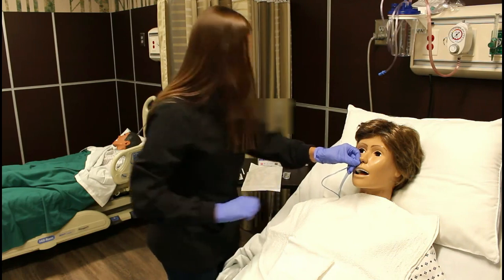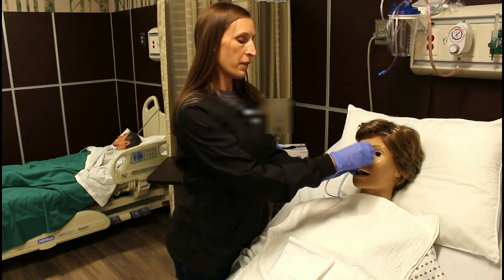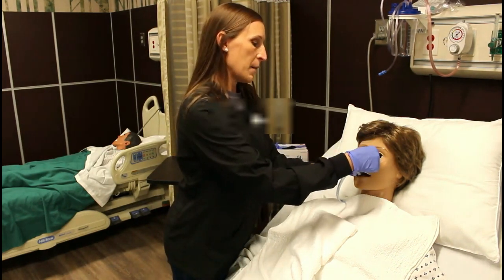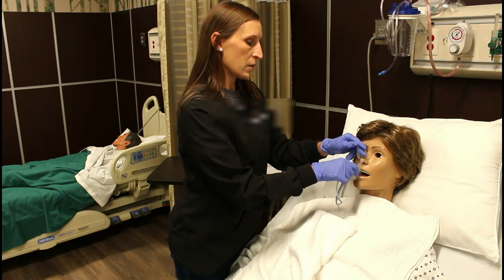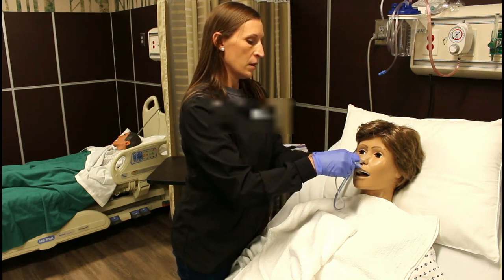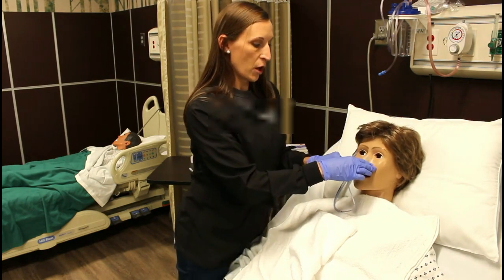Now we're going to take an alcohol pad and wipe the top of the nose off — don't let go of this tube. Wipe the top of the nose off to remove any oil or sweat. You can dry it with a washcloth if you like. This is where your bifurcated tape comes in. You will apply the tape on the bridge of the nose. Many nurses tape this differently and that's okay — this is the way I'm going to teach you. Just wrap it down the end of the tube. Take the other side and go the opposite direction. Now your tube is secure. Put an extra piece of tape right here across the bridge of the nose — be careful not to put it directly on that soft tissue underneath the eyes.